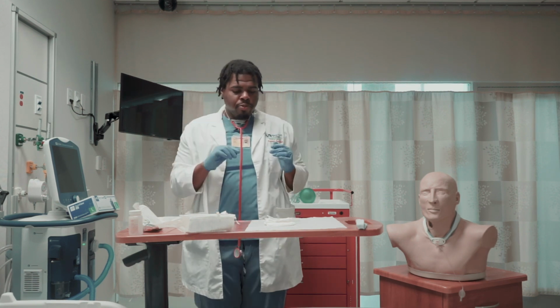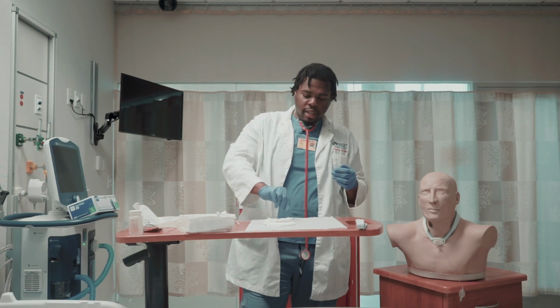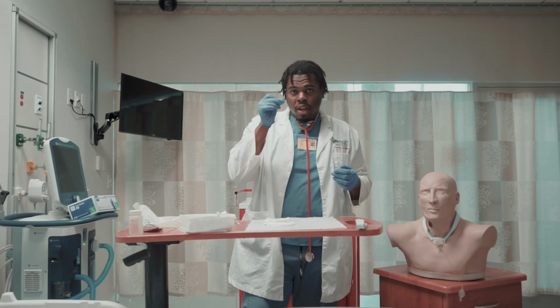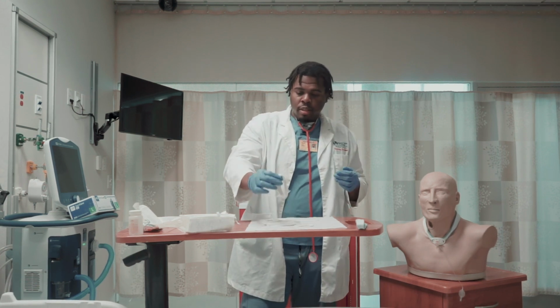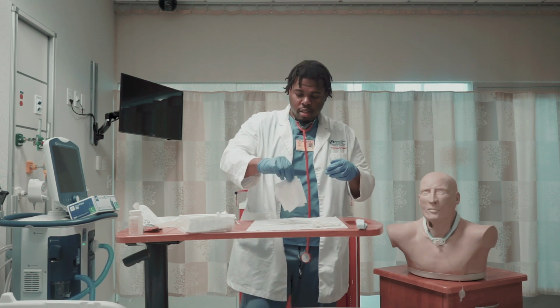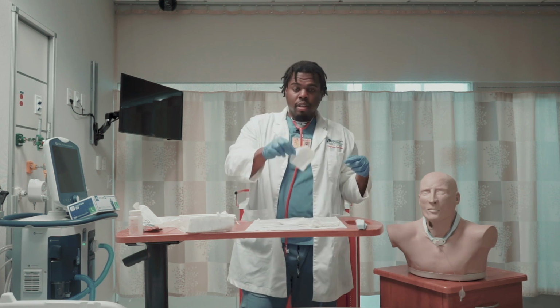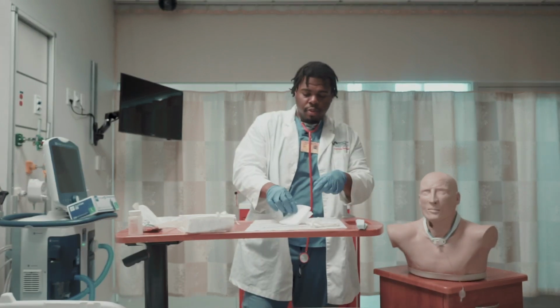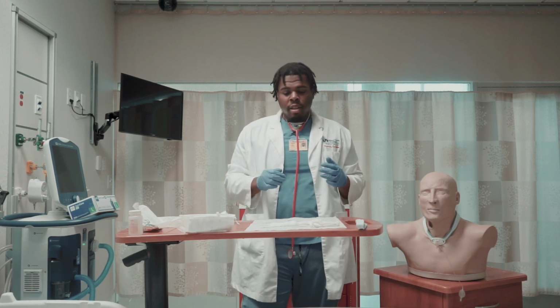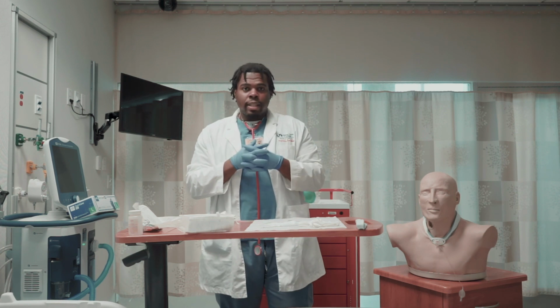Now that I'm sterile, we're going to separate all the contents of the tracheostomy care kit: pipe cleaner, sterile cotton tip, twill tape, brush, gauze, and a new dressing. Now that I've separated everything, I'm going to remove his inner cannula.